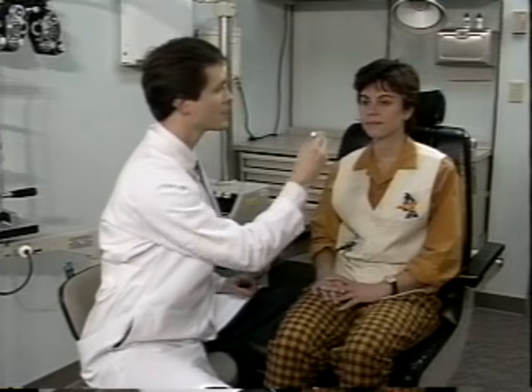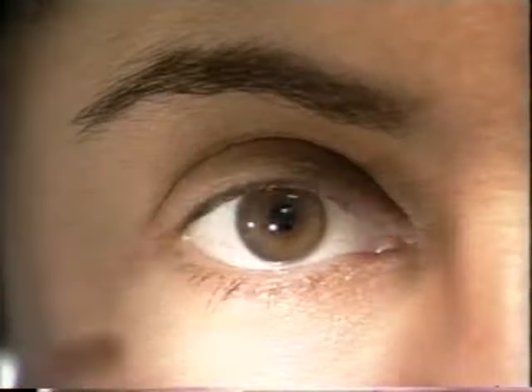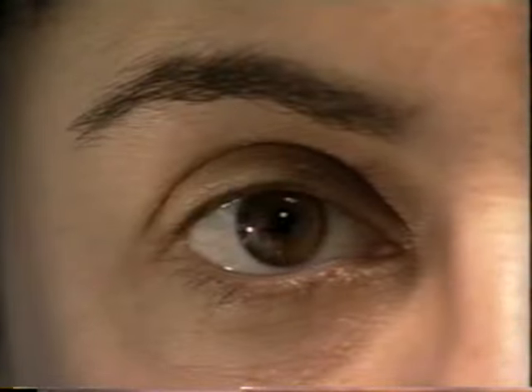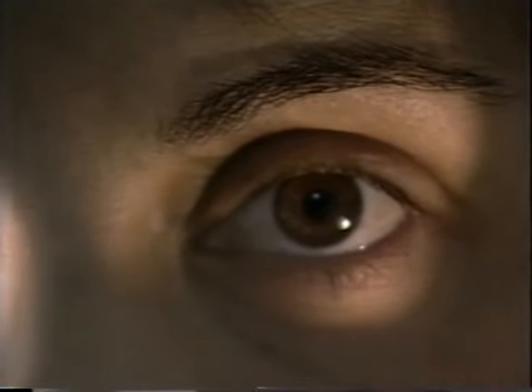Next is the pupillary examination. While your patient fixates on a distant target, look at the size and shape of each pupil. Shine your light into one of the eyes. This should cause constriction of the pupils in both eyes. The constriction of the pupil in the first eye is the direct response, while the simultaneous constriction in the other eye is the consensual response.